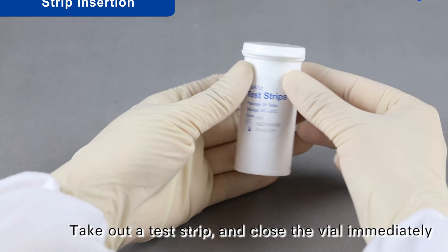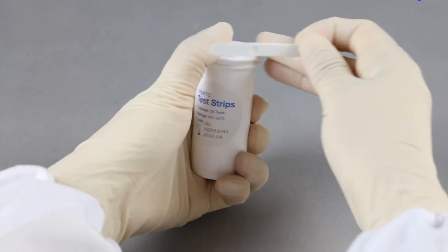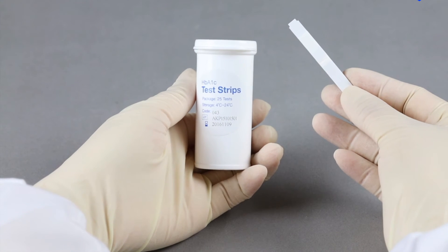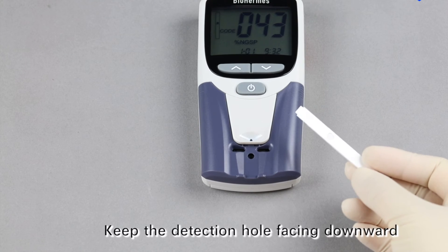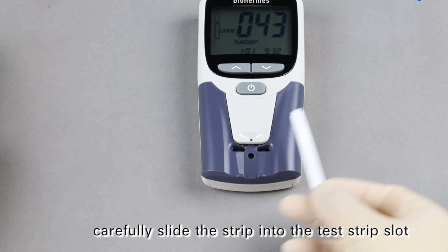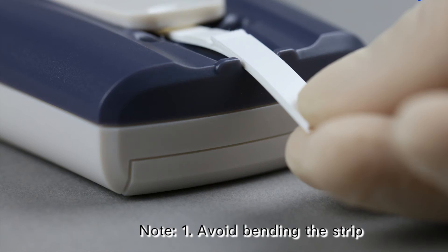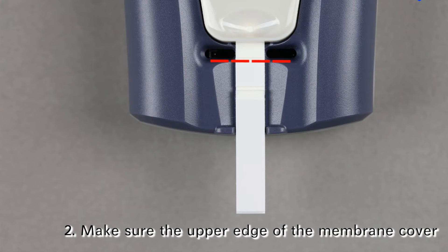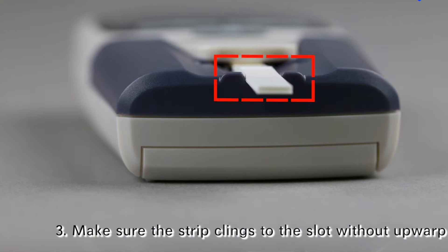Strip Insertion. Take out a test strip and close the vial immediately. Insert the test strip with the detection hole facing downward. Carefully slide the strip into the test strip slot until it contacts the end of the slot. Note: avoid bending the strip; make sure the upper edge of the membrane cover aligns to the lower edge of the sampler port; and make sure the strip clings to the slot without upwarp.